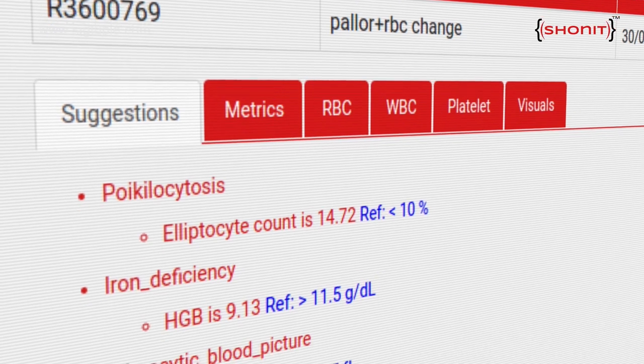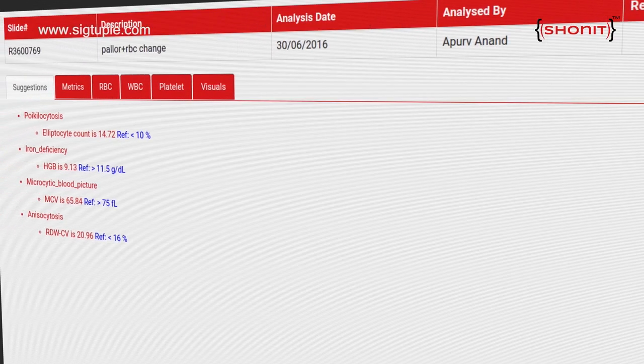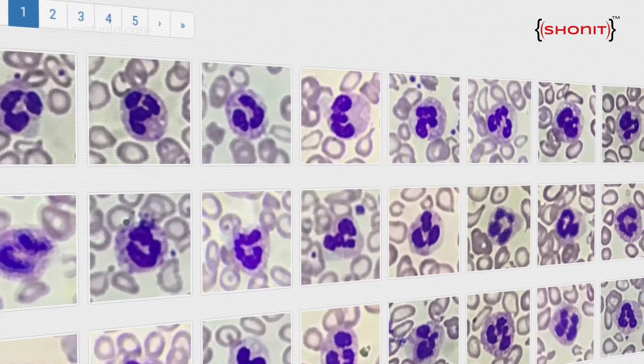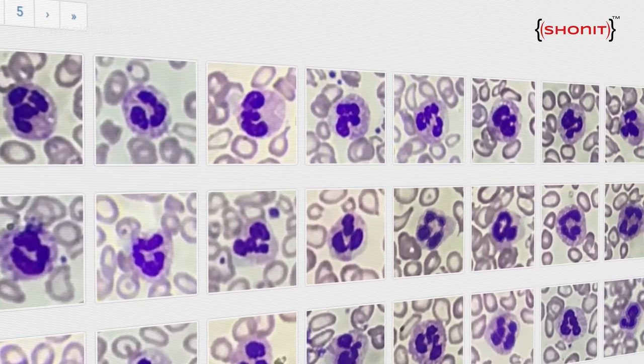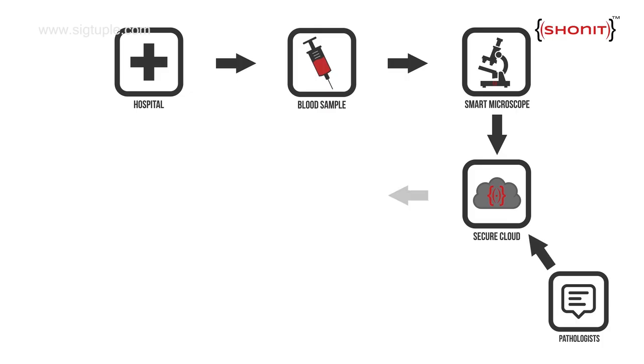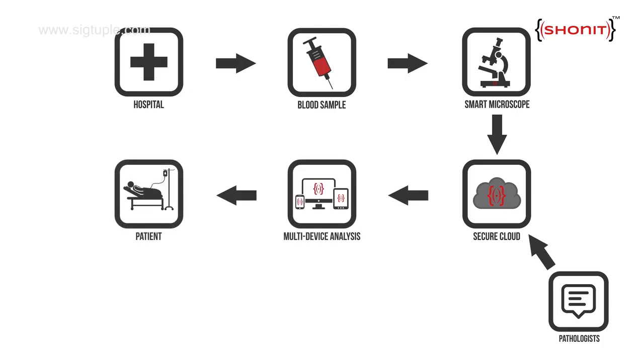These include something as simple as anemia to something as complex as blood cancer. Finally, we have a visual section which shows all the cells that we have seen, counted, and analyzed. This takes away the need of the pathologist to physically look through the microscope at the slide, as whatever information is needed is already available in the web-based interface. This means that the pathologist and the blood sample need not be co-located.